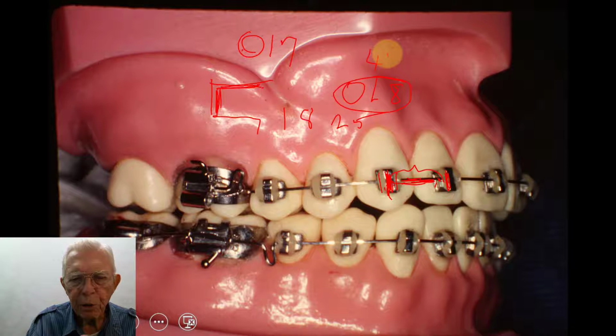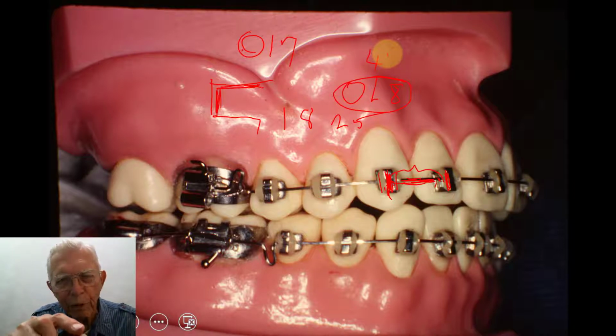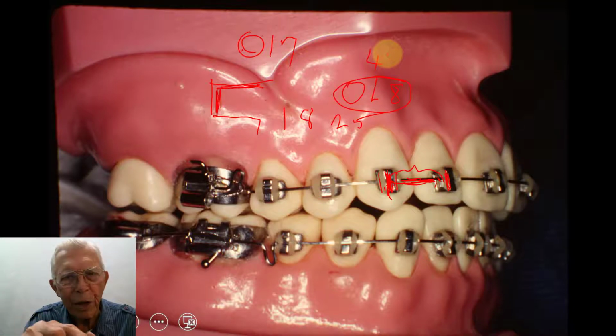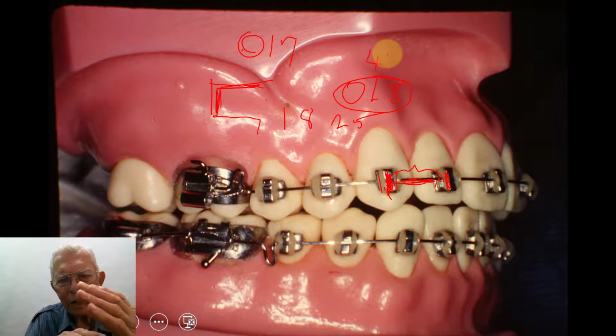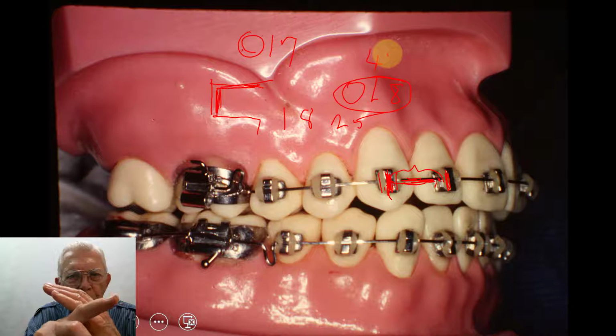Now, this whole thing of torque is something people really don't understand fully. They think they'll put straight wire appliances in there that have a certain amount of torque, and if you put a bracket in there exactly that size of that slot, then you would end up with that exact torque. But the problem is, when your tooth is out of place and the bracket is the right torque, when you put the wire in there, you've got a lot of torque to correct it. But as the tooth gets closer and closer to where it should go, the amount of force that the wire produces goes down too, and you get close to where you want to be, and it looks like it'll never go there.